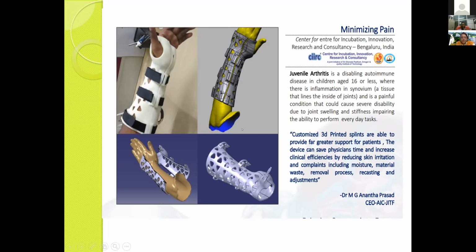I think this type of scanning can already be done using maybe a face scanner or an extraoral scanner. When do we particularly want to have a lab scanner? If we can scan with the available scanners, why do we need a lab scanner to scan?